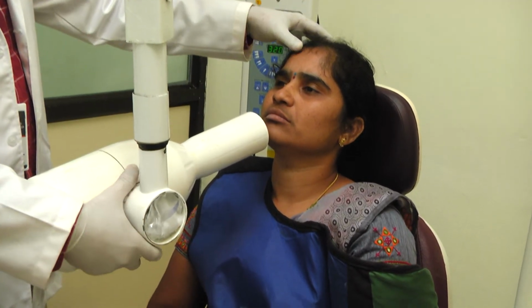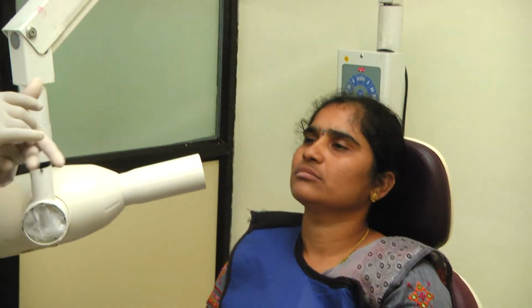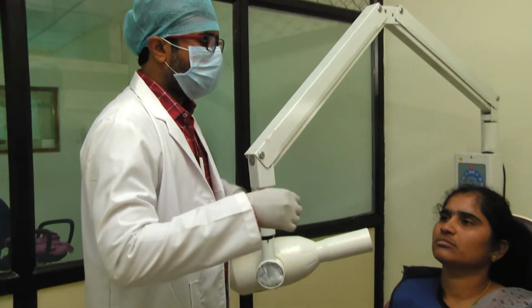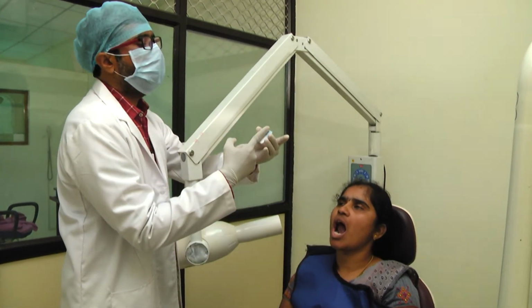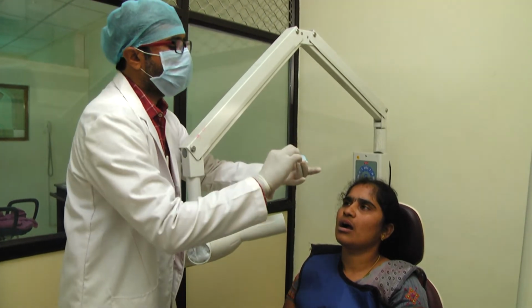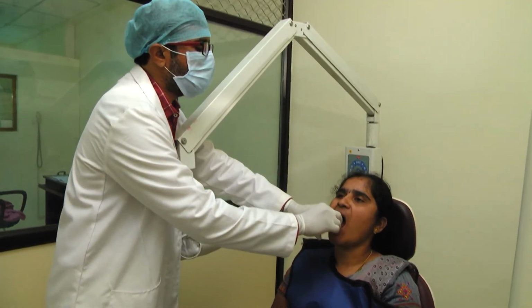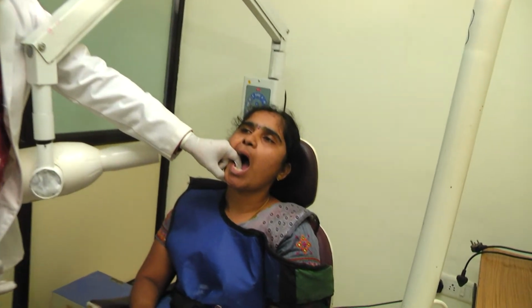And while taking for the mandibular canine, the placement of the film is such that the canine should be exactly in the center of the film. Here also you slightly bend the film by supporting it with your index finger, so that it follows the curvature of the arch. And this is how the placement of the film is. Once the film is placed and held by the patient, now adjust the vertical angulation.